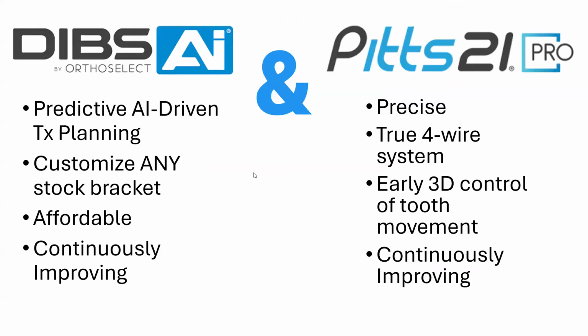Kind of in summary, these are just two excellent companies, and I love the direction they're going. DIBS, we have their predictive AI-driven treatment planning. You can customize any stock bracket. It's affordable, and they're getting better every day. Pitts, it's precise. It's a true 4-wire system. You're getting 3D control early on, and they're getting better every day.